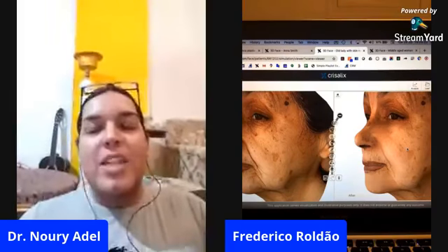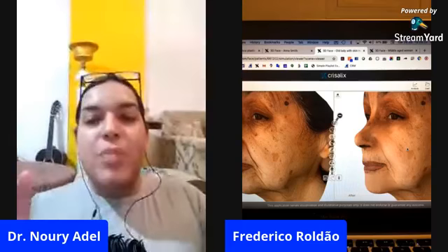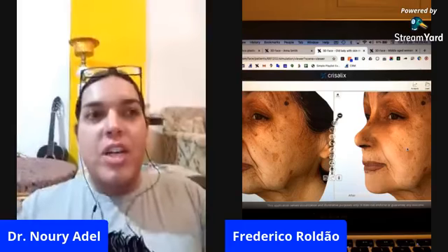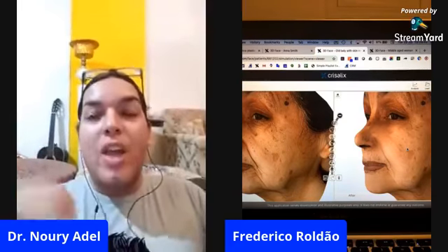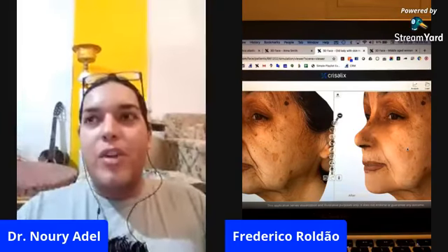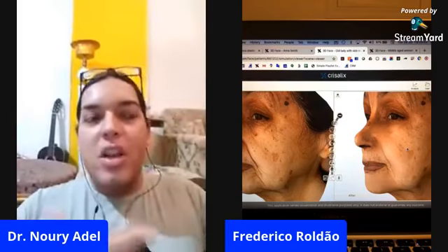Because 80% of my patients are always asking me how they're gonna look, despite how many pictures I show them from previous cases or from other people who did this aesthetic procedure. They still have this fear of how they're gonna look. So if I can offer them even a little bit of a virtual imagination of how they are gonna look after my intervention, I guess this is gonna be a fabulous thing.